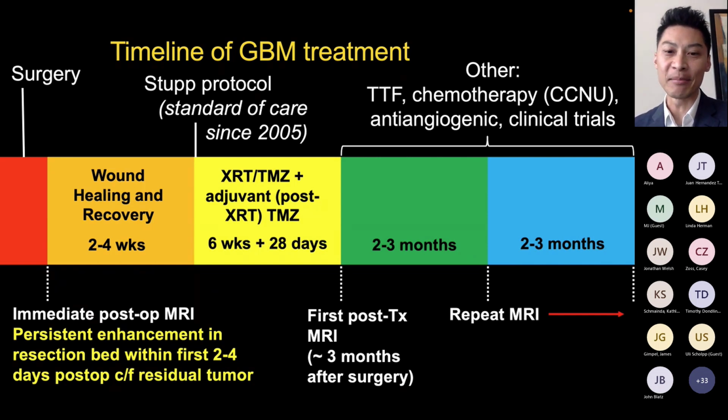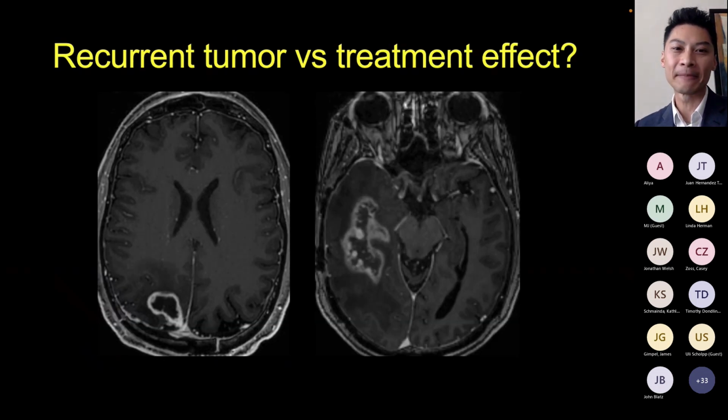And this is just to say that because the patient is getting consistent serial imaging every 2 to 3 months, I think it's important to leverage that and include a consistent protocol, for example a perfusion protocol, at each time point, because you can see that changes within the brain tumor microenvironment happen pretty quickly. So it's important to catch that as much as you can. That has benefits over, for example, imaging a patient at one time point with PET or something, and then going based on that, right? Because oftentimes these changes happen really quickly. You really need to capture it on a more consistent, early time basis.